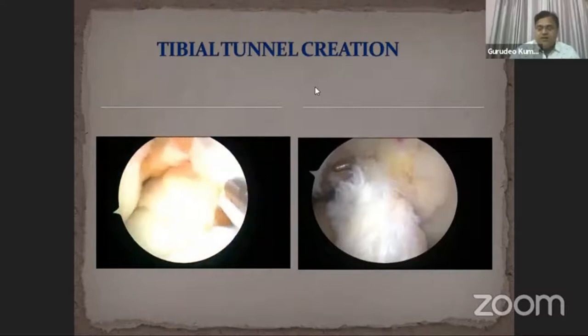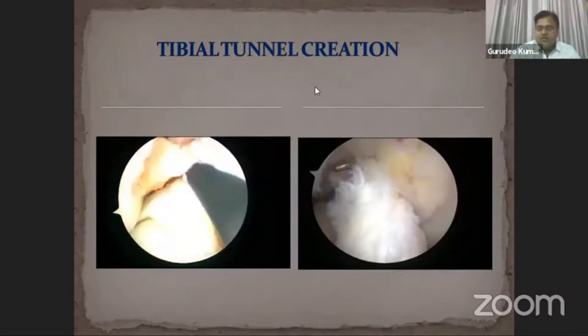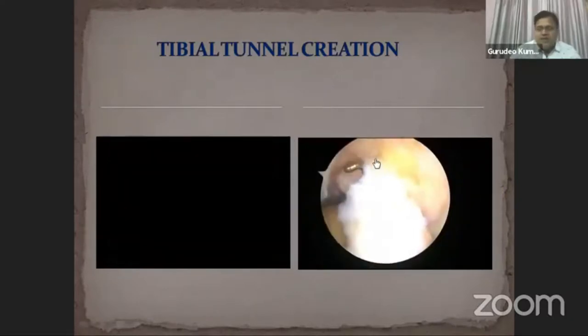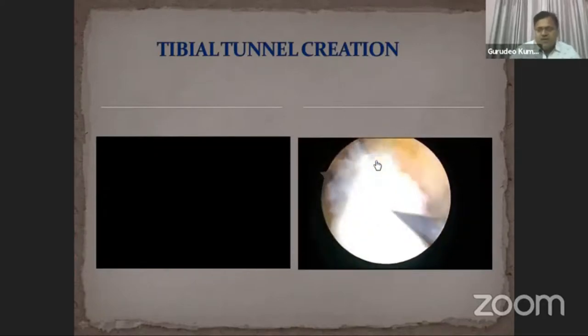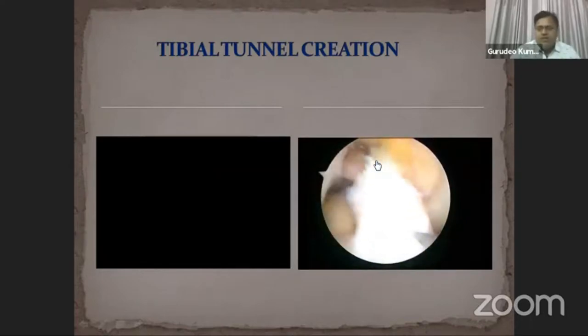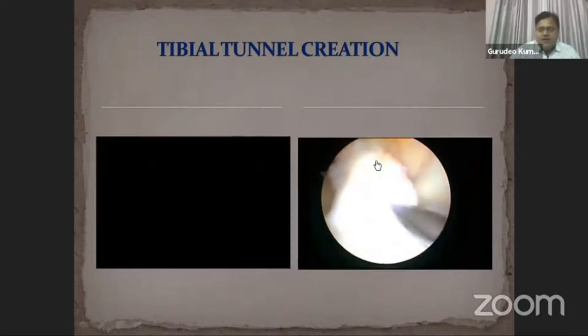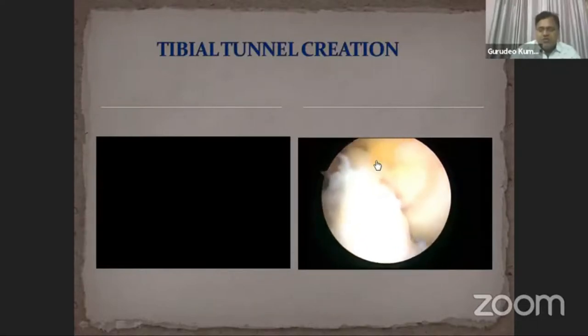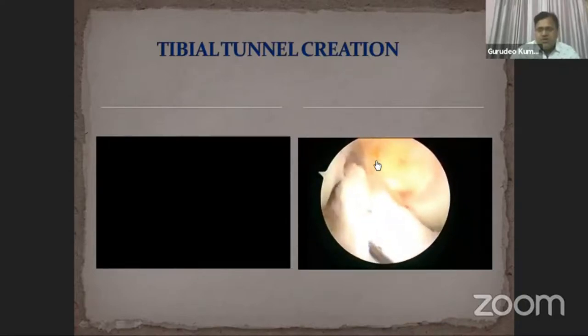The final drilling is made by hand so as to prevent rupture of the tibial remnant footprint. Then we insert the probe inside the tibial tunnel. We use an 11-number scalpel to create a mid-bundle window between AM and PL, then use straight artery forceps or a probe to separate both the AM and PL bundles.